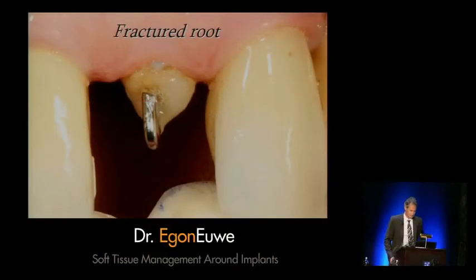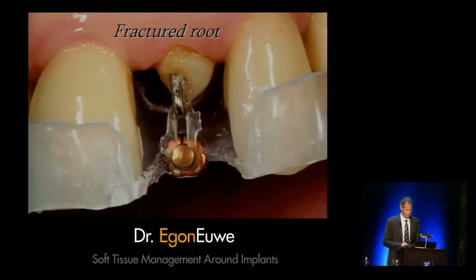I will show you, this is the fractured root. This is a very simple homemade orthodontic device. Aesthetic for this patient was not very important at that stage. So it's important that you extrude. Actually, we don't want buccal tipping of the root, because we will lose buccal bone, and this can make sometimes things worse. So it's very important that the root goes down straight.